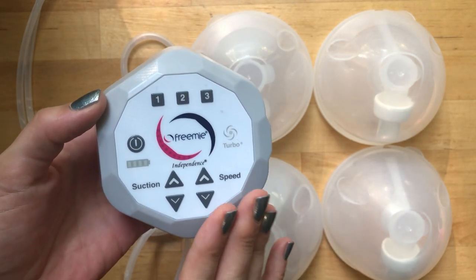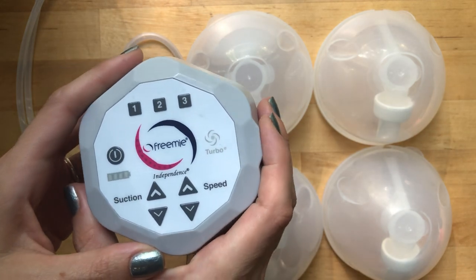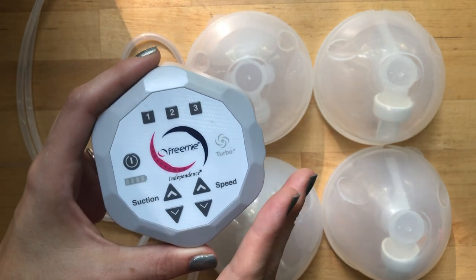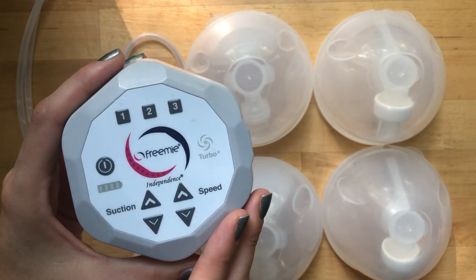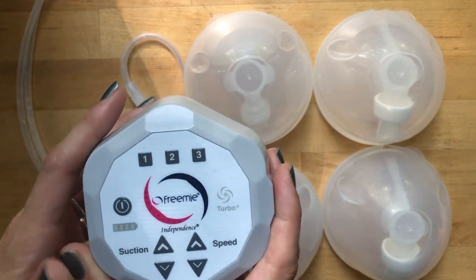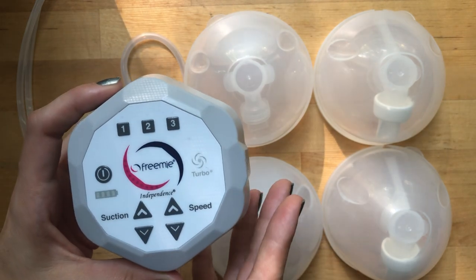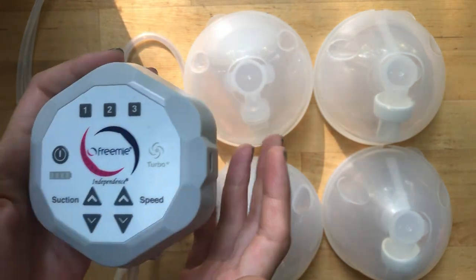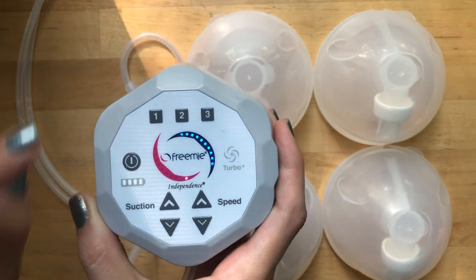As far as suction and speed go for a cordless pump, this one is great. I've tried some of the low-cost alternatives on Amazon and I really wasn't impressed with the suction - over time they tended to lose suction, probably due to the motors wearing out. I've had this one for about five months, using it daily, and it hasn't seemed to lose any suction. It doesn't have as much suction as a Spectra or Medela that plugs into the wall, but that's simply because you get more power when plugged in.